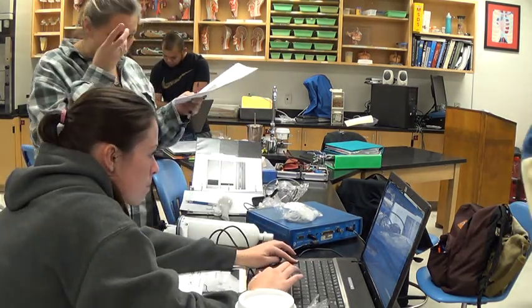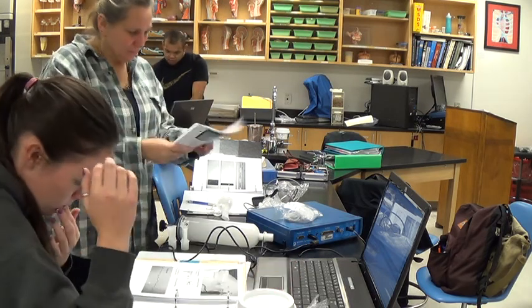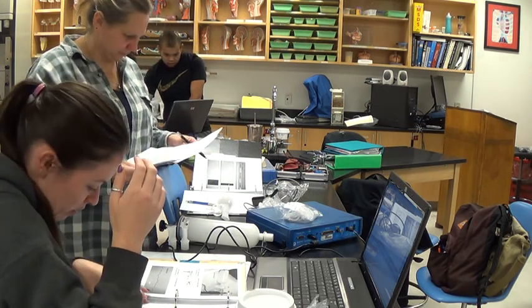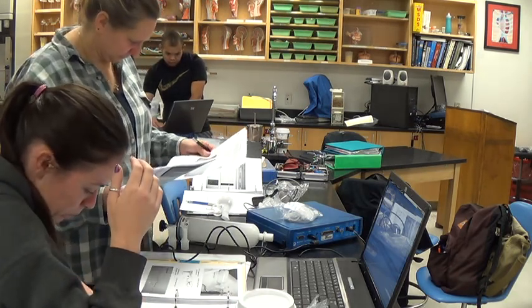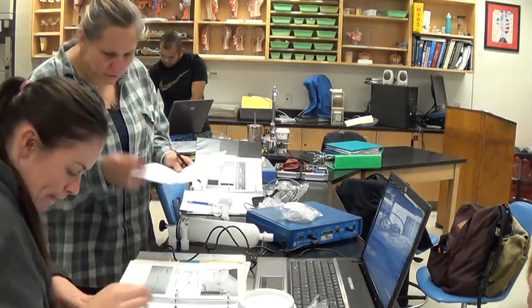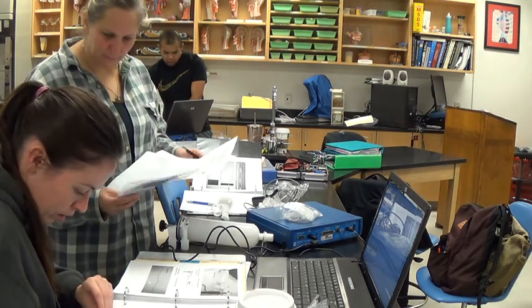So how do you calculate the FVC? You're going to take from there to the lowest value. Highlighting it, uh-huh. And then read the PP again. And then divide that first value at 1 second by the total FVC. Did you guys get it? Yeah, I got the number.